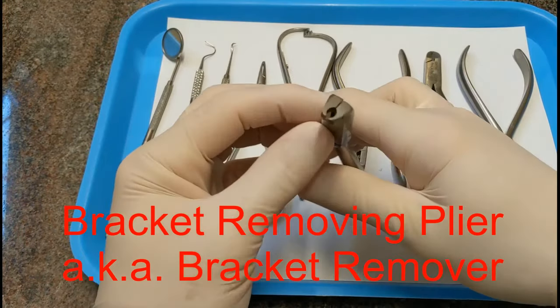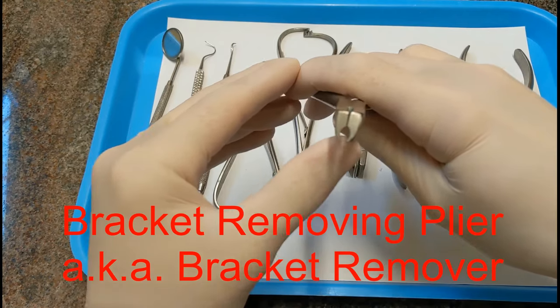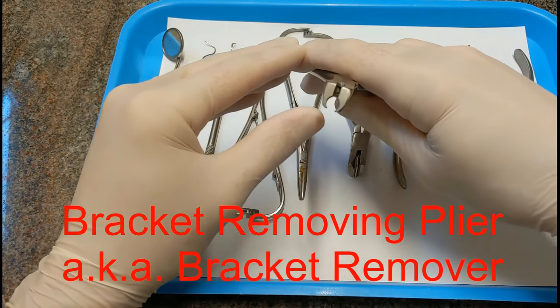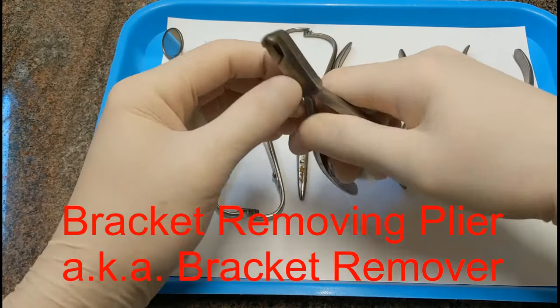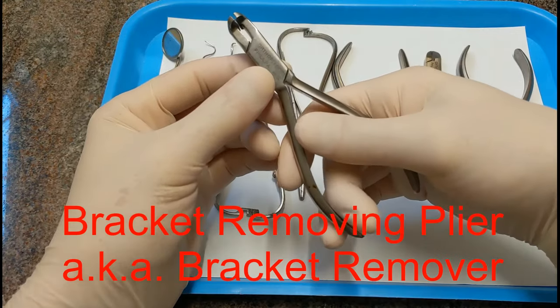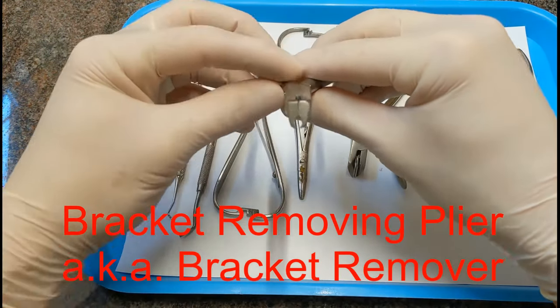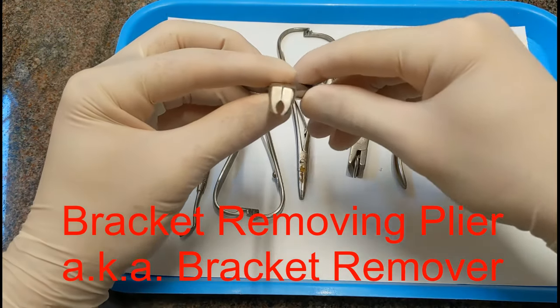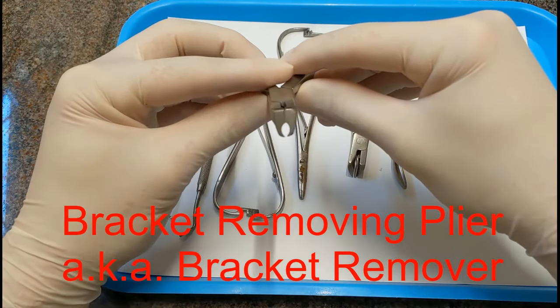This is called a bracket removing plier. Its jaws don't quite touch, and you use this to remove brackets — you get it around the bracket, squeeze, and that distorts the bracket and gets it to pop off the tooth. You use these when you want to take the brackets off and not reuse them, because it distorts the bracket. If you were going to reposition the bracket, you'd use something else, but this is just for removing and discarding them.